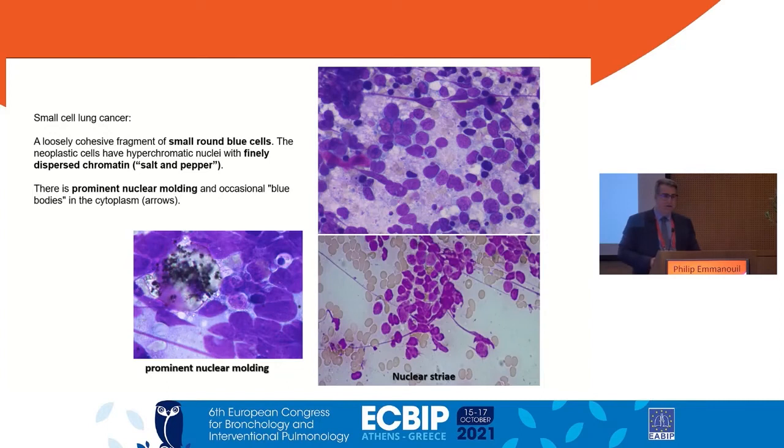In the case of small cell lung cancer, we see quite a little different picture. The cell size is medium. The cells are a little bit bigger than the lymphocytes, and they are cuboidal in shape because, due to the large proliferation of small cell lung cancer, the cells are packed in the lymph nodes, so they're deformed and cuboidal. And also when we stain it, they tend to be friable, so they're broken, and chromatin striations are present. This is produced by the smearing of the slide.